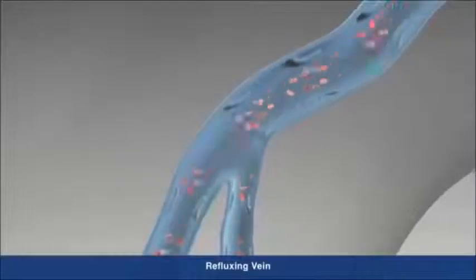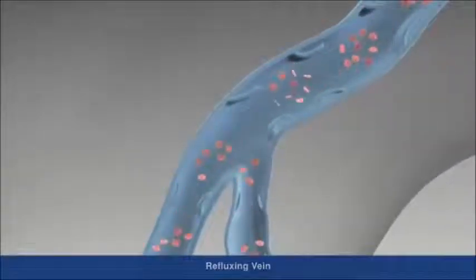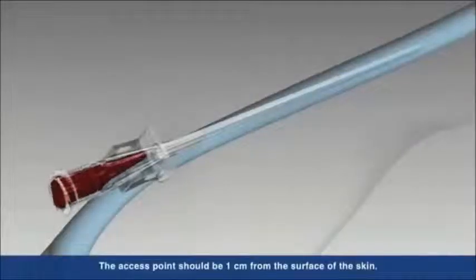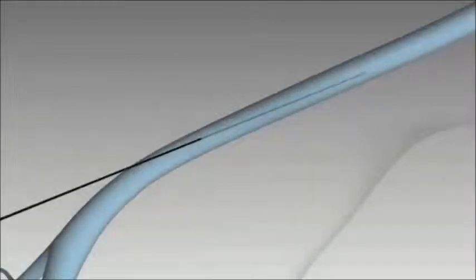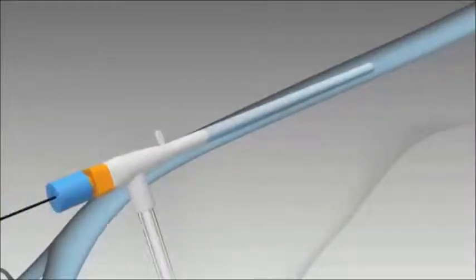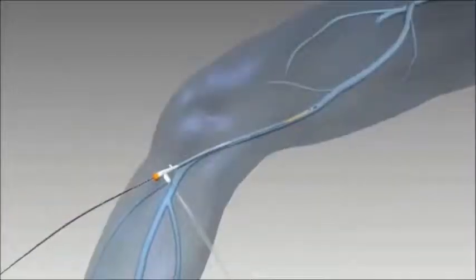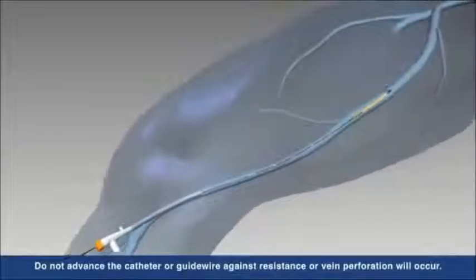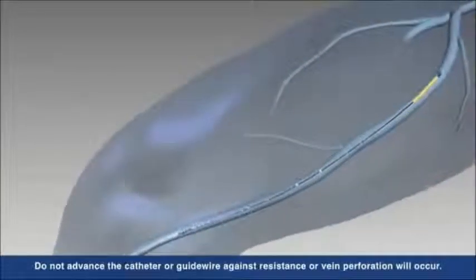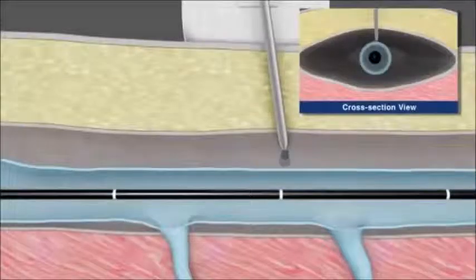Under ultrasound guidance, the vein is accessed using standard endovascular technique by inserting a seven French sheath into the vessel. The closure fast catheter is inserted into the vein and advanced up to the saphenofemoral junction or the SFJ and positioned two centimeters from the SFJ, again under ultrasound guidance.